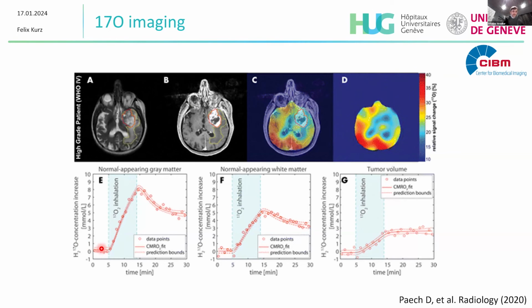Also with temporal resolution, so you see how after oxygen inhalation the signal goes up. Here for gray matter it goes up, a little bit less for white matter, and much less for the tumor volume. Thinking back 100 years, Warburg hypothesized that in tumor tissue you have non-oxidative glycolysis that leads to lactic acid fermentation. It's basically a visualization of the Warburg hypothesis.